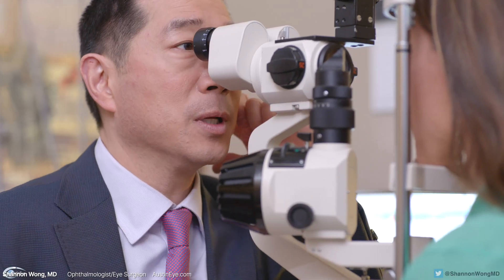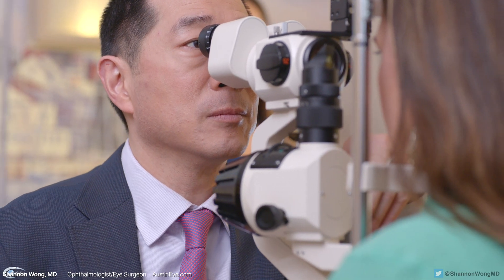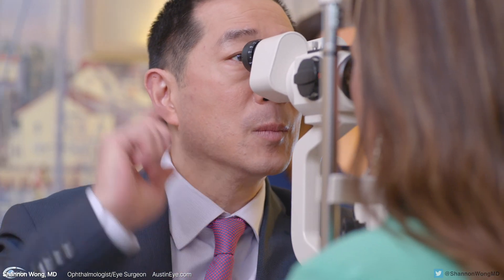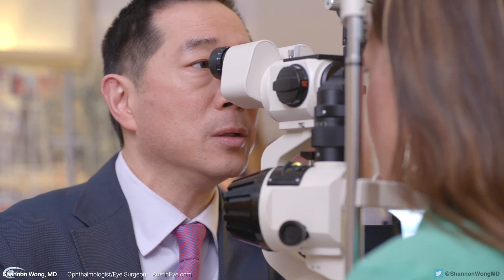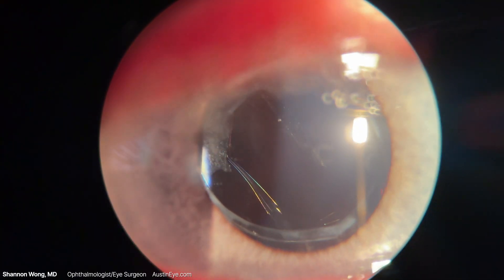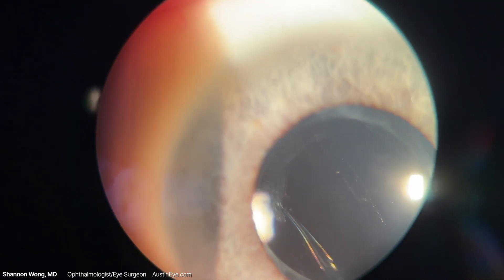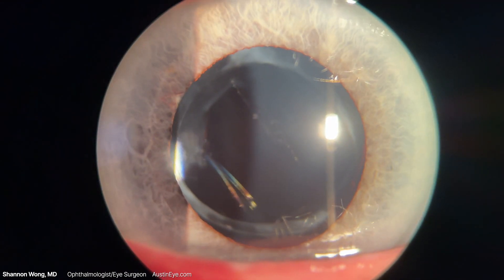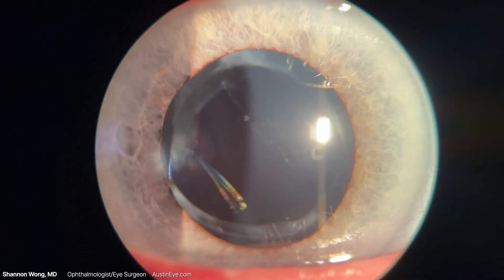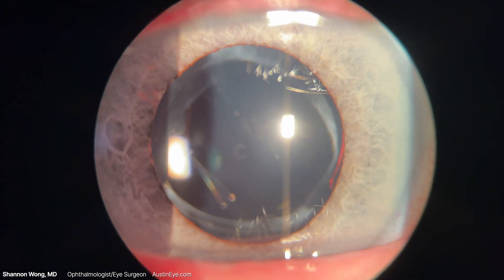During the preoperative eye exam, we determine if an intraocular lens exchange is the appropriate solution to help the patient achieve their visual goals. Then we dilate the pupil to make sure that the anterior capsulorhexis is well centered between 4.5 to 5 millimeters in diameter, and if there is 360 degrees of anterior capsule overlap of the lens optic.